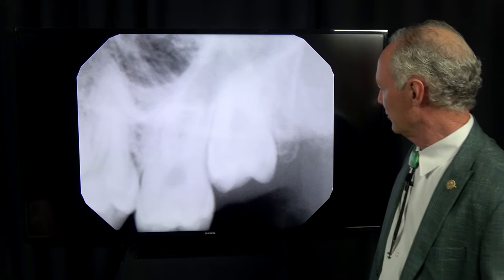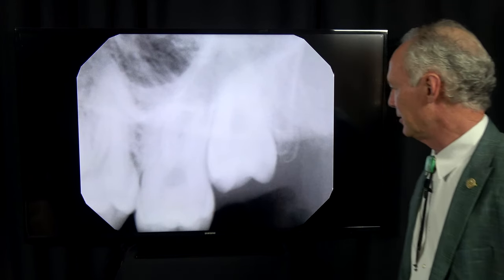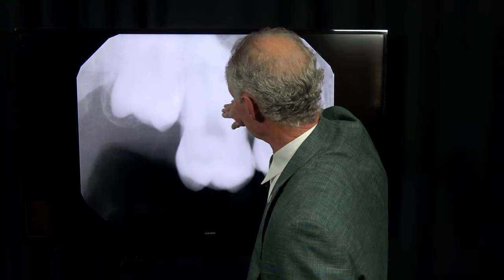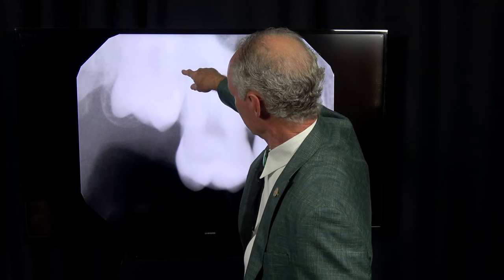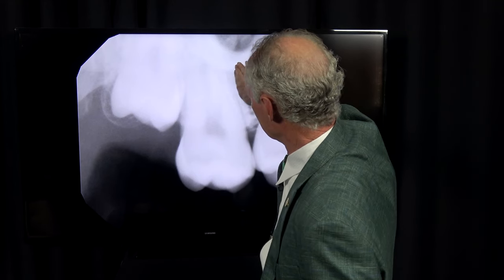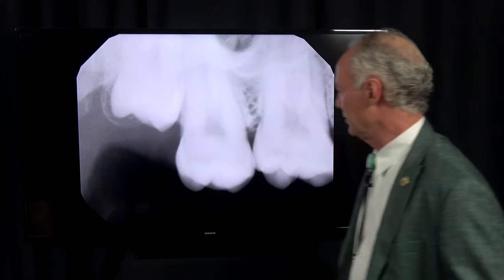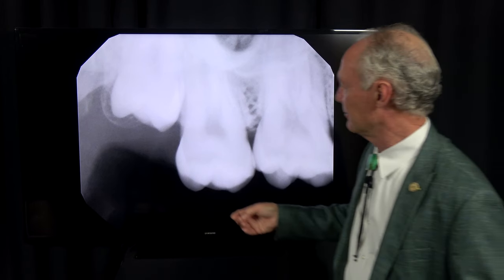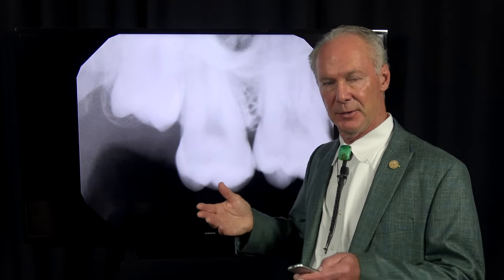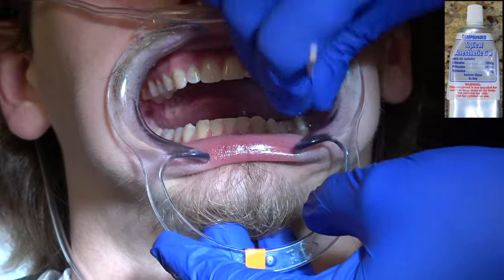The other thing that made it difficult was finding a purchase point where you could place an elevator and elevate the tooth. This other one was even higher but see how it's just planted against this tooth. To elevate it you'd like to get down to the root, but it was so tight against the tooth in front that it was difficult to place an instrument in that space. Bottom line: with impacted wisdom tooth extraction, you'd really like to extract them when the patient is 16 to 18 but with only about 25% of the root formed, so they're easier to extract.